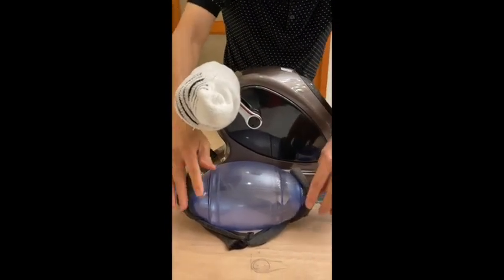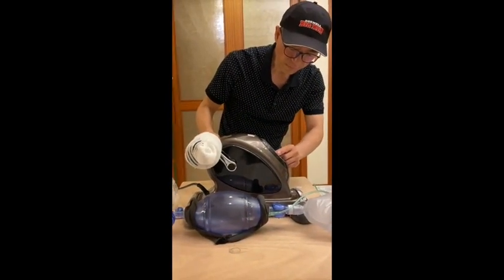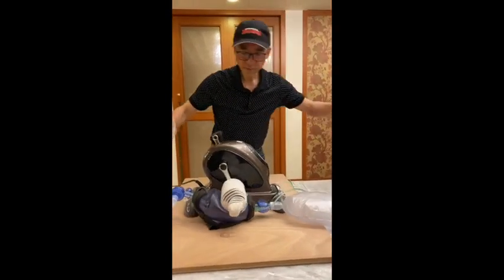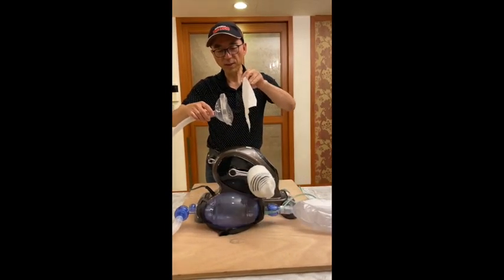Let me show you this improvised machine works. The machine is now running at 14 cycles per minute.